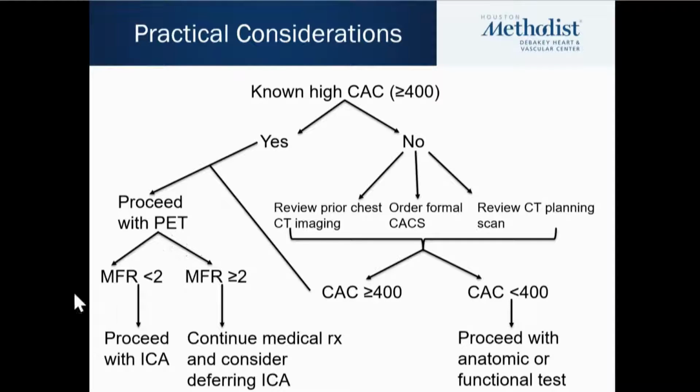If their MFR is less than 2, I think this is highly concerning and warrants consideration of invasive angiography. On the other hand, if their MFR is more than 2, I think maybe use it as a reason to defer, for now, invasive angiography, but importantly focus on medical treatment.